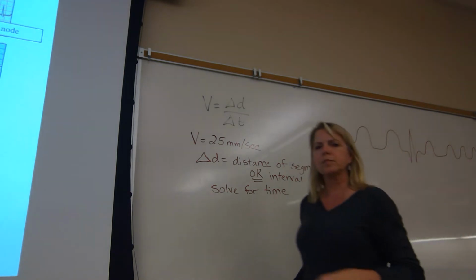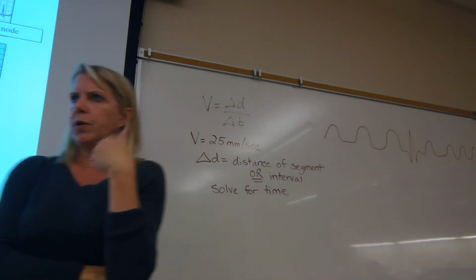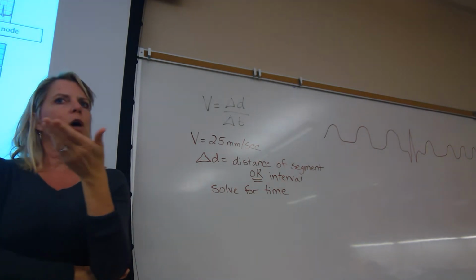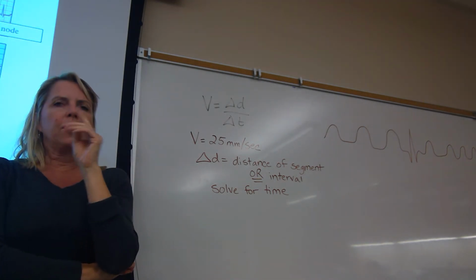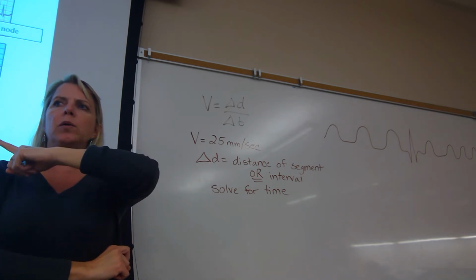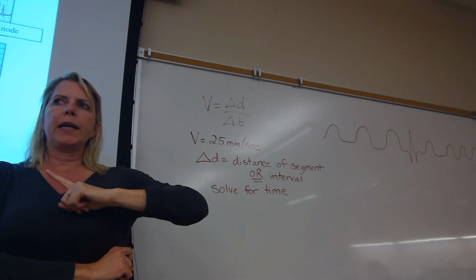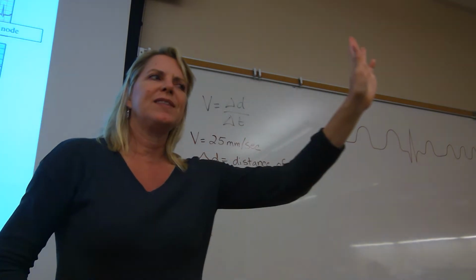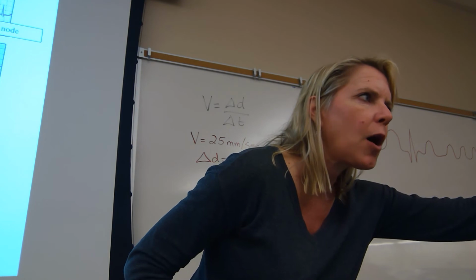Now, I told you when I was teaching you your cardiac vectors on Tuesday, I showed you a vector showing you atrial repolarization. Remember, it was pointing up to the right. And I said, but this isn't one of the 5 you need to know, remember?